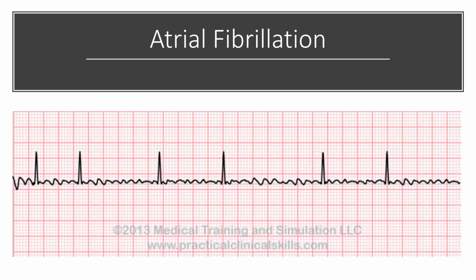This is another slide that has atrial fibrillation. Again, we can look at the ventricular rate. We can see that the distance between R to R's is irregular. If we're only looking at the ventricular rate, we can say in this slide it's 1, 2, 3, 4, 5, 6, 60, but look at all those P waves. We can say there is more than one P for every QRS. We can't measure the PR interval because there are way too many P's and we wouldn't know what to measure, but we can measure the QRS complex and it's still narrow.